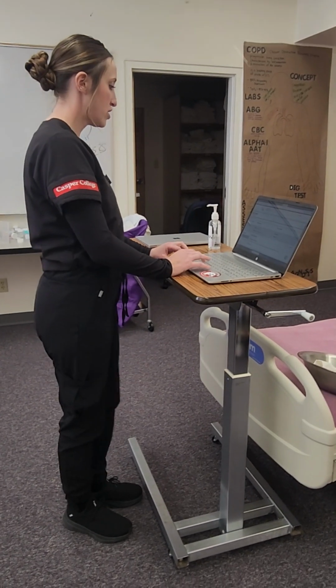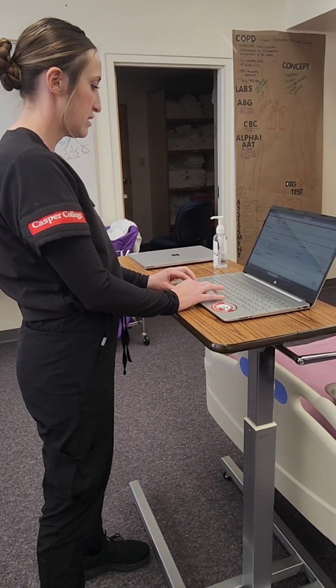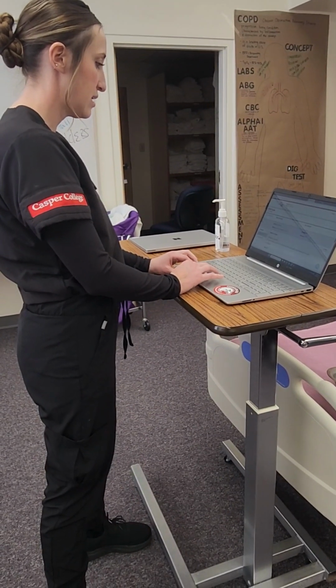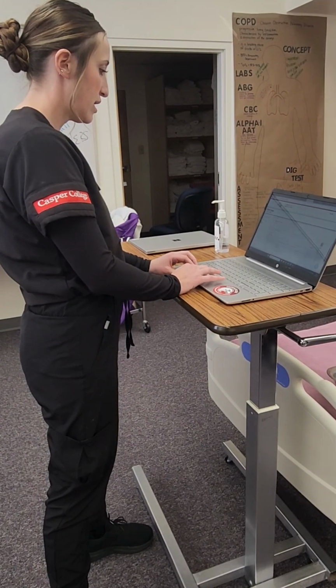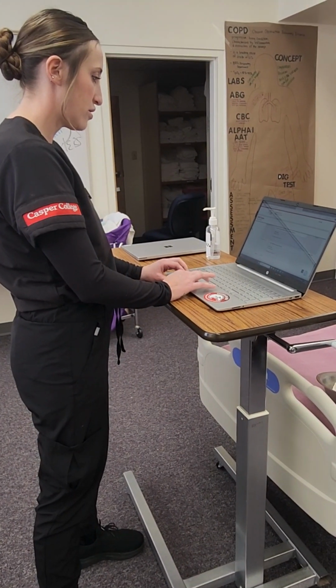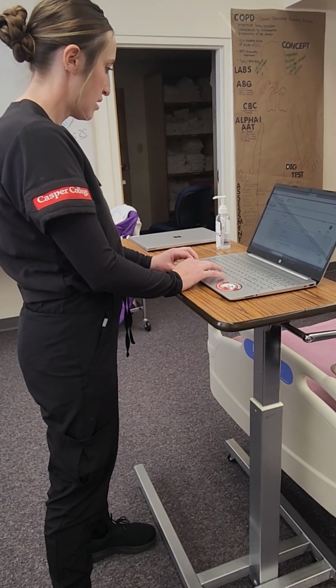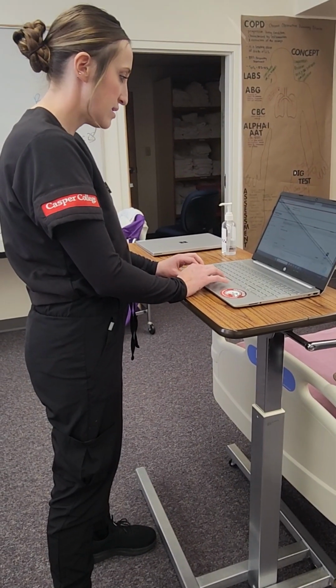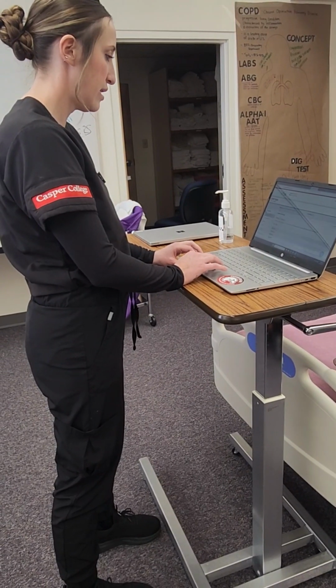I'm looking in the EHR and I have a patient, Jerry Batch. He's a male, birth date 6/16/19XX. He is allergic to iodine. Looking in his orders, I have an order to discontinue his indwelling urinary catheter. Doesn't say in here, but I would look for the reason he had one and how long he had it.